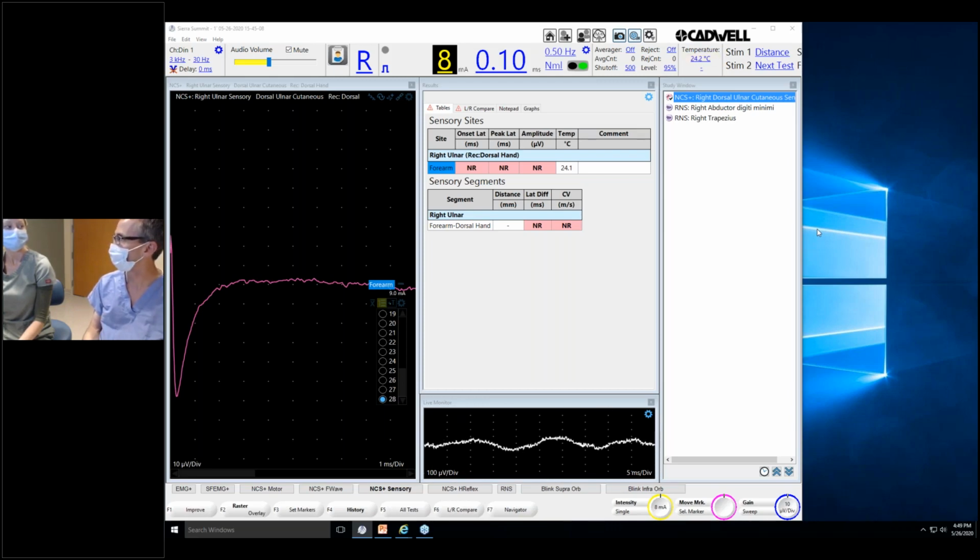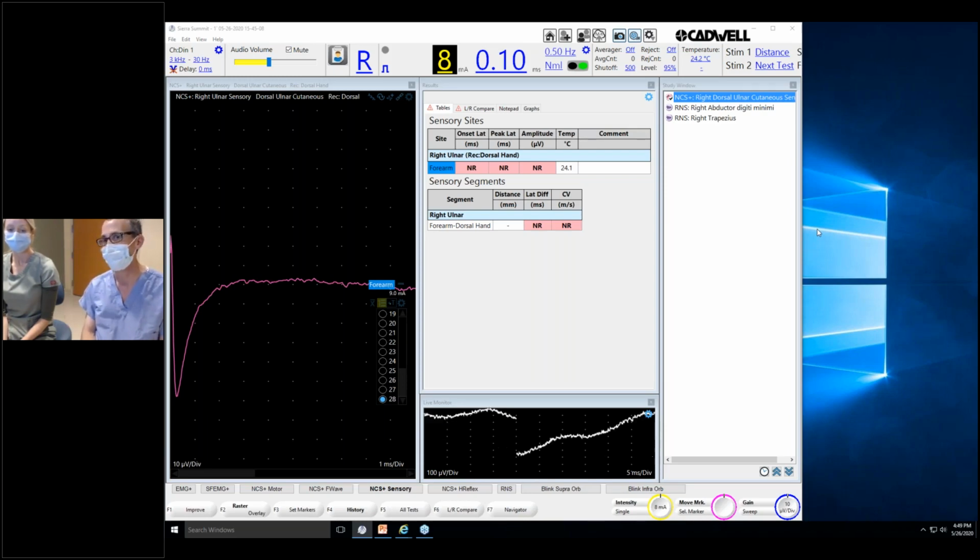What do you think? The most common nerves we do are what? Probably spinal accessory and facial. Spinal accessory and facial. So we'll demonstrate both of those. That's because in myasthenia, proximal nerve-muscle combinations have a higher yield than distal ones. Particularly if someone comes in with symptoms of just bulbar weakness or diplopia, the likelihood of finding abnormalities in a more distal nerve is fairly low. We often do ulnar, and sometimes we'll do a peroneal or anterior tibialis also.